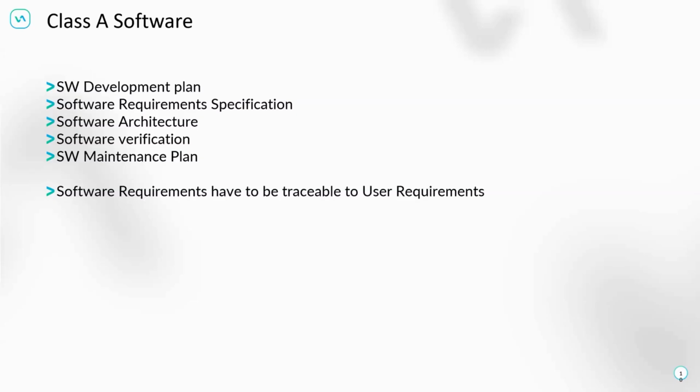That is, for instance, metrics, code metrics, and all that additional criteria. So metrics, additional verification criteria, as well as the targets for that, are actually only mandatory for Class C software. However, I always recommend everyone create a few little code metrics you can use quite simply.